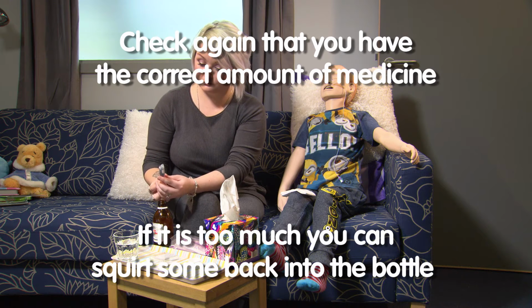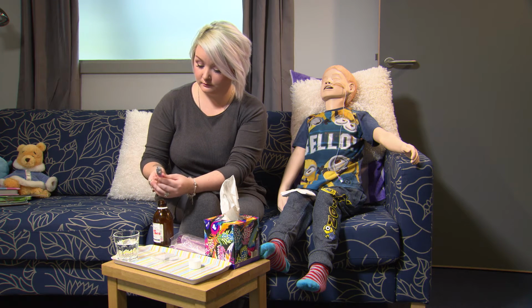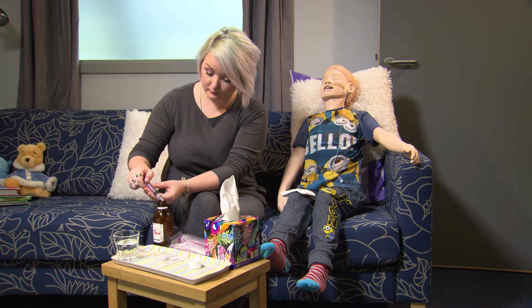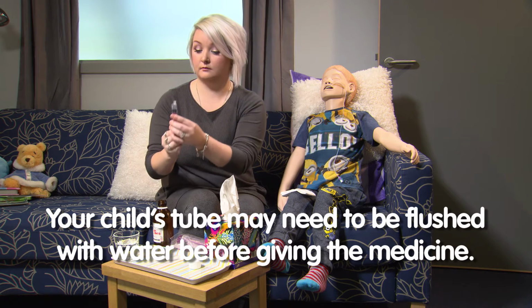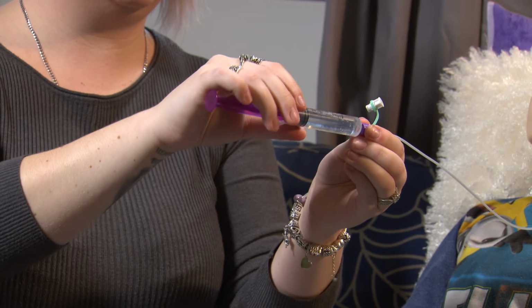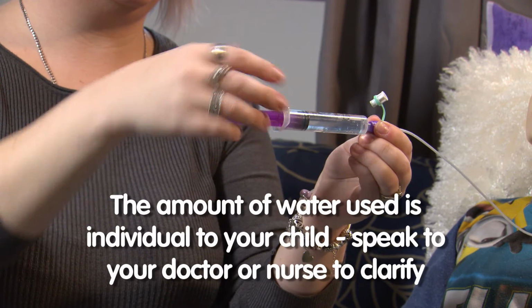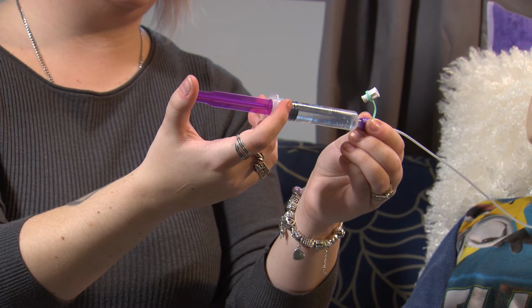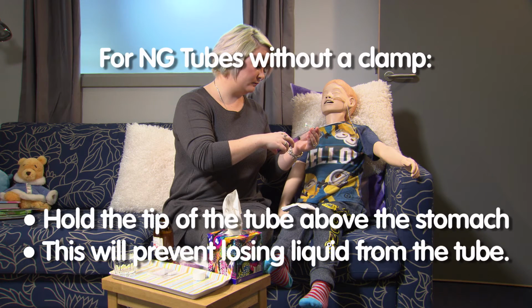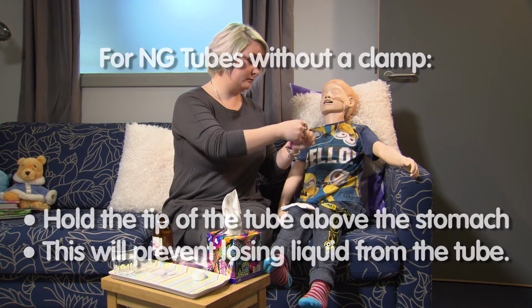Once you are sure you have the correct amount of the medicine, you can start the flush. If your child's tube is being used for a feed, then you must stop the feed and flush the tube with water before giving the medicine. The amount of water used to flush between feeds and medicines is individual to your child. Speak to your doctor and specialist nurses to clarify this. If you have an NG tube without a clamp, you need to hold the tip of the tube above the stomach to prevent you losing liquid from the tube.